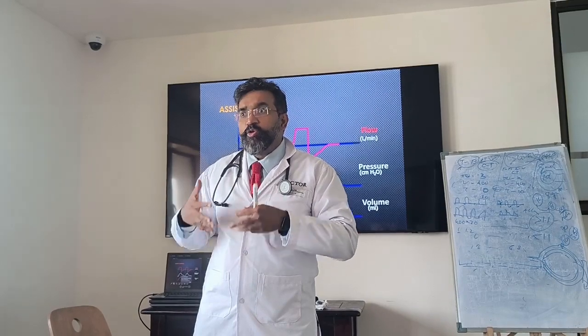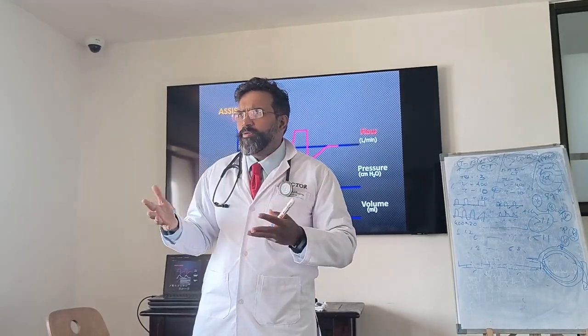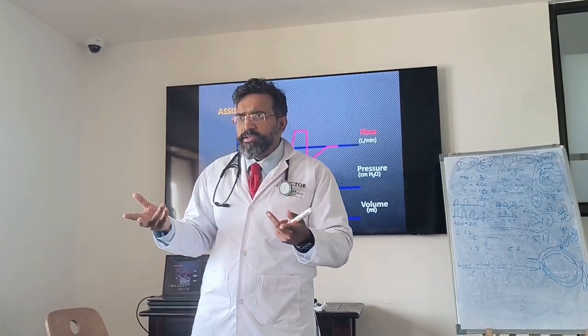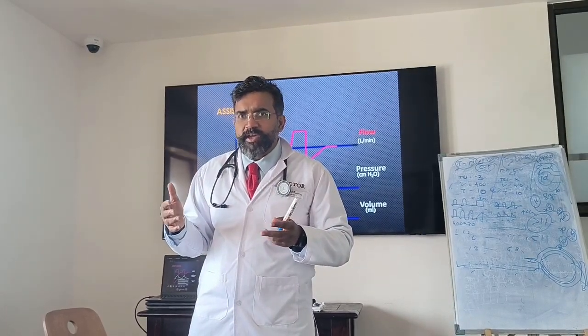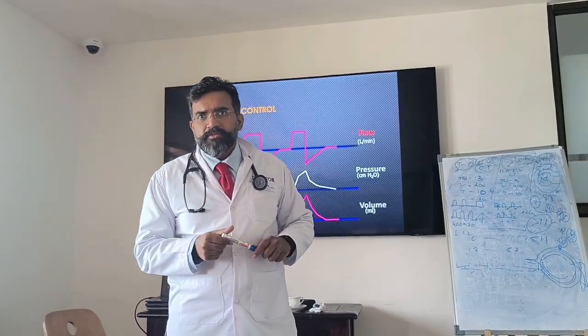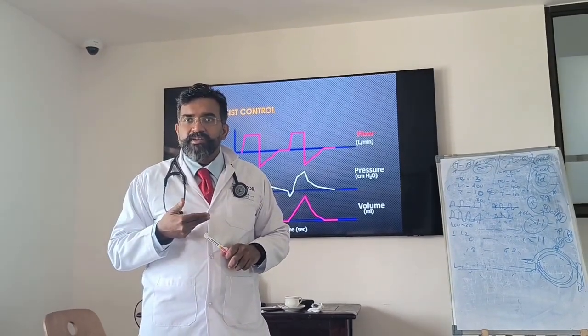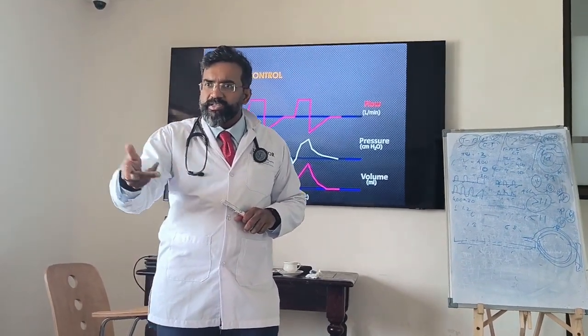डायनामिक हाइपरइंफ्लेशन हो जाएगा, ओवर डिस्टेंशन हो जाएगा, फुग्गे जैसा बड़ा हो जाएगा, वो बैरोट्रॉमा होगा, दुनिया भर का प्रॉब्लम होगा. बार-बार ओपन क्लोज अगर हो रहा है तो एटेलेक्ट्रॉमा हो जाएगा. बार-बार तुम उसको एक लंग को स्ट्रेस कर रहे हो ना, उसमें इतना बार आरआर हो रहा है. Because everything is उल्टा. It is no longer negative, positive जा रहा है. So it's a different form of ventilation. समझ में आ रहा है ना?